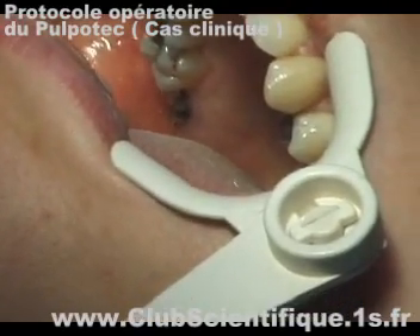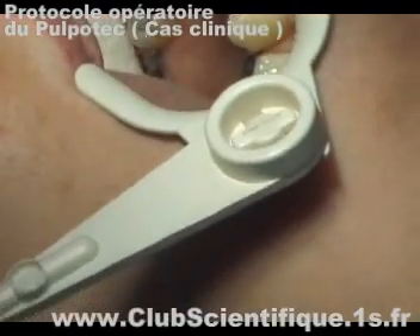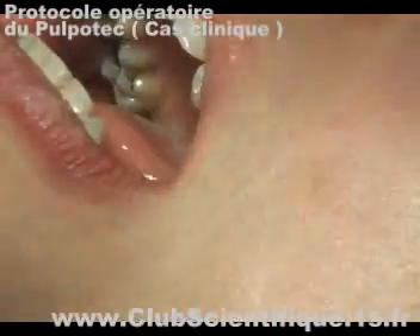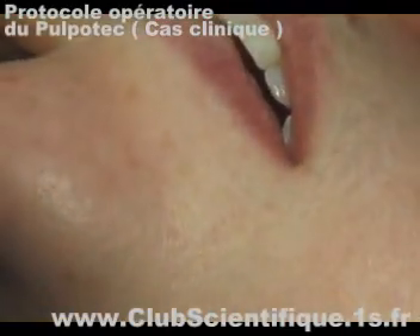Place a cotton roll between the dental arches and ask the patient to bite it firmly and progressively so that the Pulpotec clings to the walls of the pulped cavity as well as to the root canal orifices.